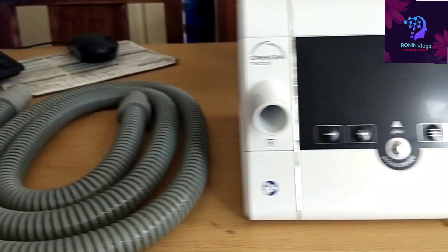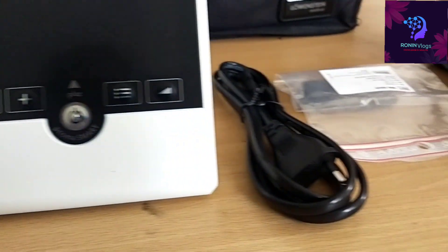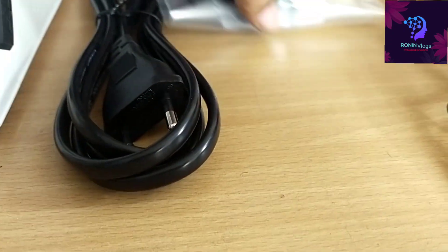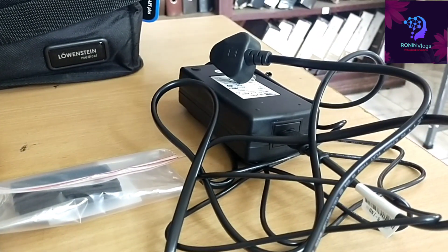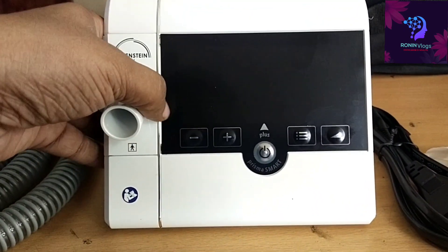This machine has an optional humidifier — the humidifier is not attached here. Along with the CPAP, BiPAP tubing and CPAP tubing are included, as they are the same. Two power cords are also coming, along with two extra filters and one additional charger.